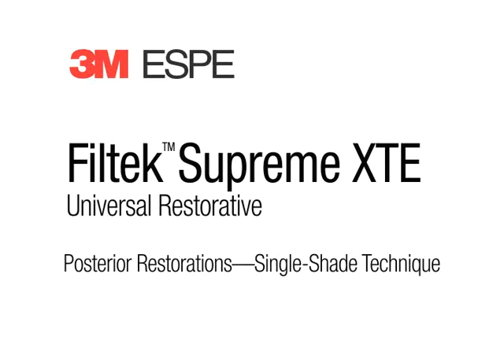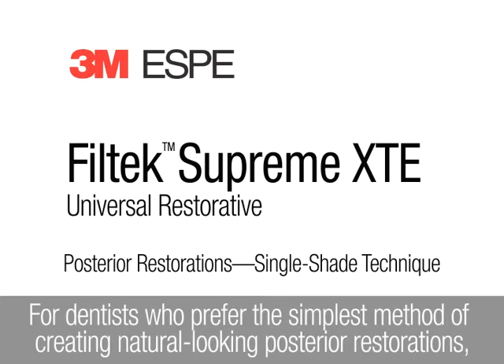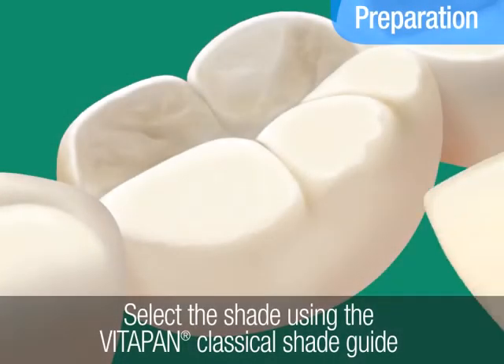Filtec Supreme XTE Universal Restorative. This animation demonstrates how to create posterior restorations using a single-shade technique. For dentists who prefer the simplest method of creating natural-looking posterior restorations, 3M ESPE recommends a single-shade technique using just one body shade of 3M ESPE Filtec Supreme XTE Universal Restorative.